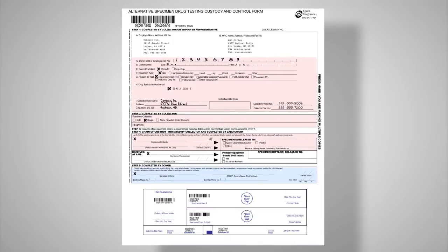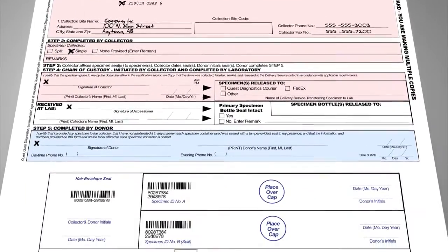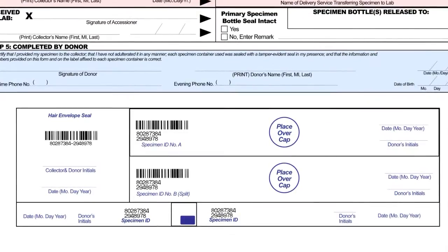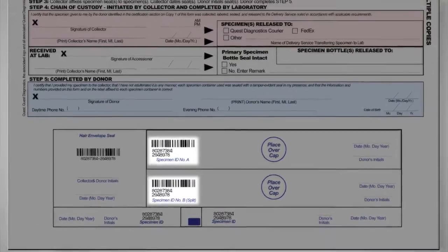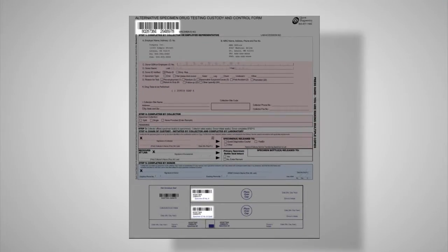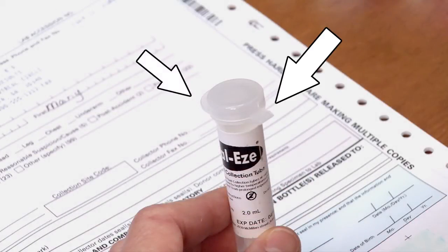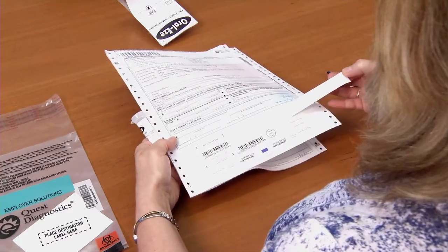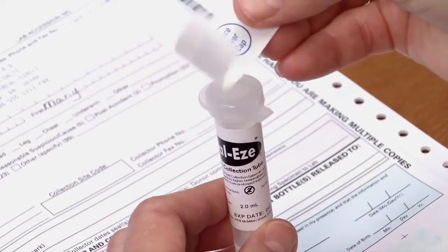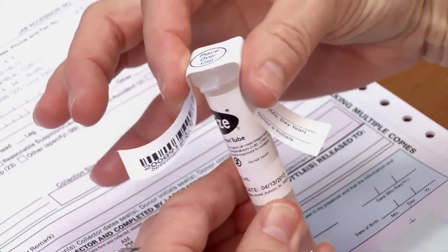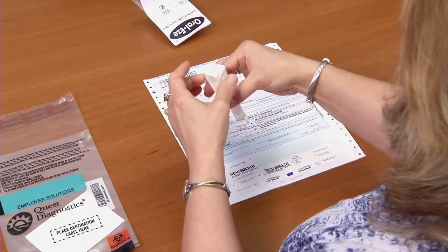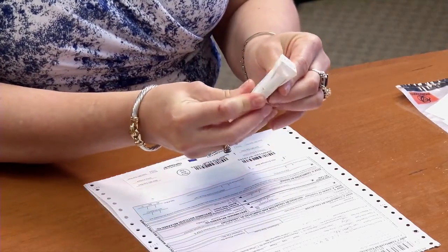Step 3. Select one of the two long specimen seals from the bottom of the custody and control form. While the seals on your form may be slightly different from the example shown, the process of sealing the collection tube remains the same. Ensure that the two sets of numbers on the seal match the two sets of numbers under the barcode on the top left corner of the form. To prevent tearing, be sure not to place the seal over the hinge or the tab of the lid. Placing the label horizontally around the specimen tube should be avoided completely. Next, place the tamper-evident seal across the top of the collection tube and down both sides.